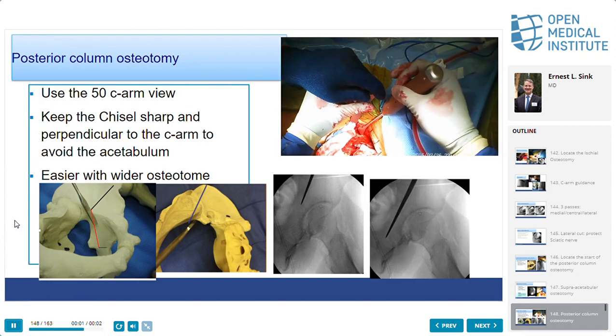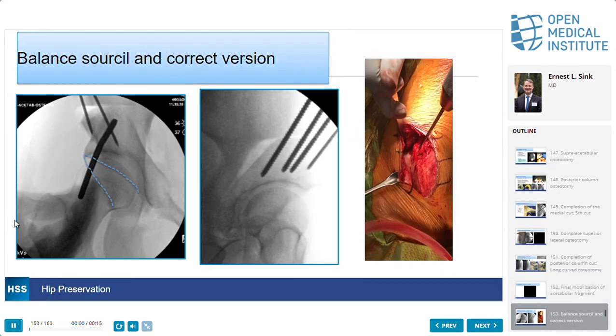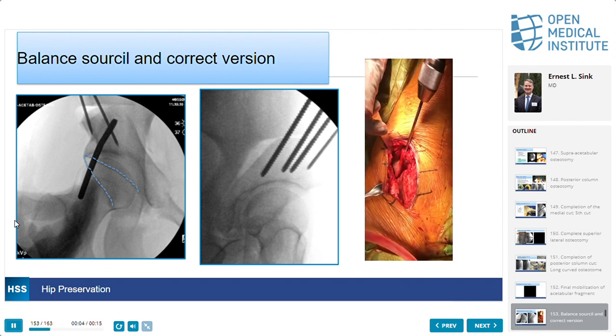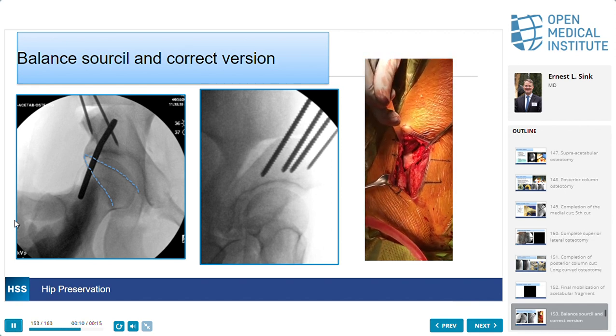We're doing the osteotomy in a very controlled environment, and repositioning it. Internal rotation, putting it where you can see anterior, posterior walls, femoral head coverage. External. Look how mobile that thing is. Okay, you can put that wherever. Good. When you get to that point where it moves, you're like, oh, good.